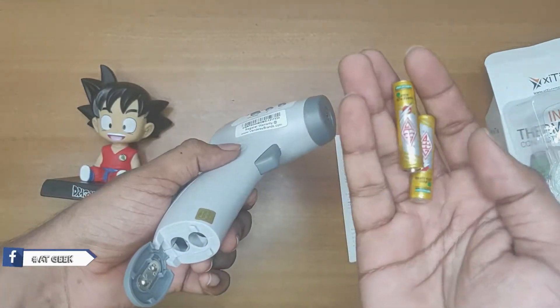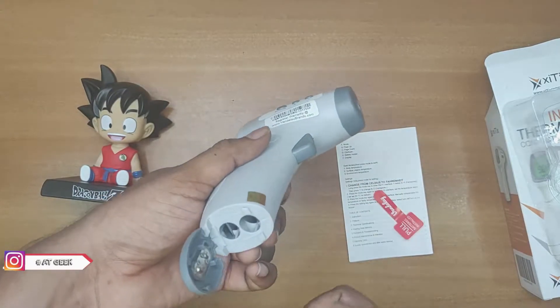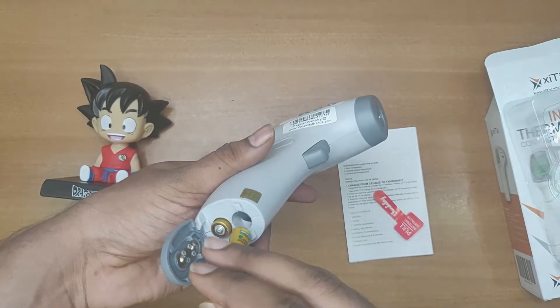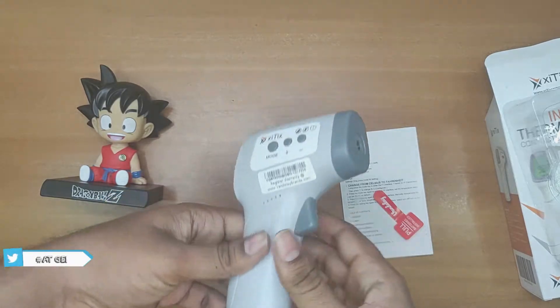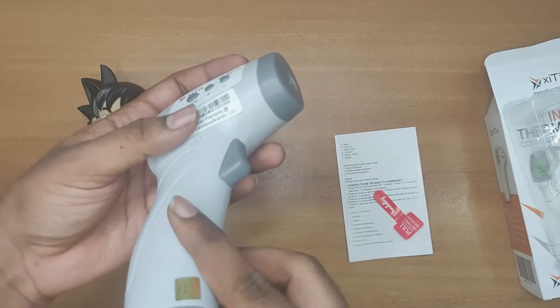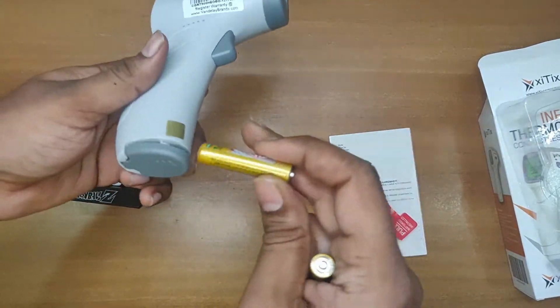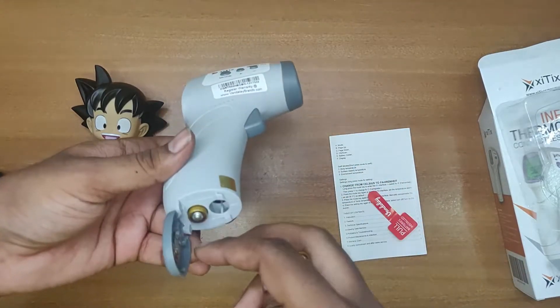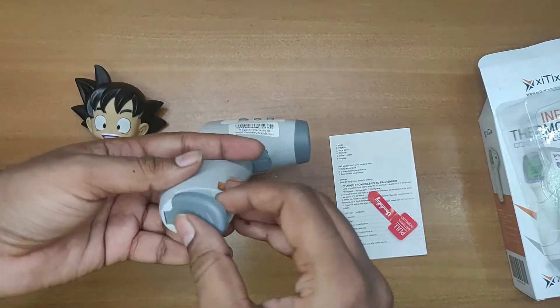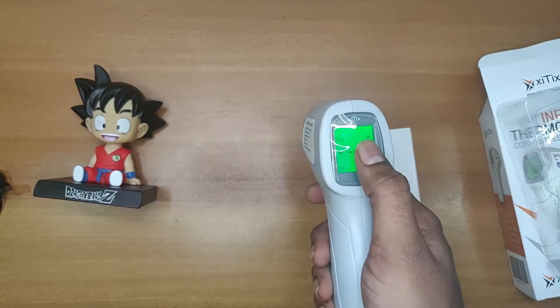We got pre-installed batteries — the company gave a pair of batteries. Let me install them. You need to install them in the correct format so that the thermometer turns on. Then you place this side and flip to the opposite side, and here we got the screen on.